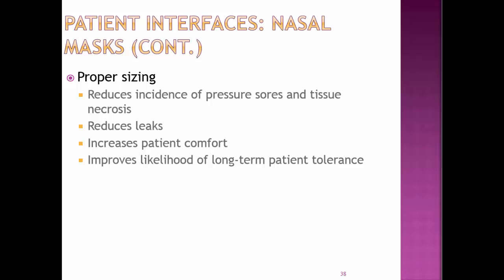Proper sizing of the nasal masks is probably the most important part of this. The proper sizing reduces the incidence of pressure sores and tissue necrosis, reduces leaks, increases patient comfort, and improves likelihood of long-term patient tolerance.